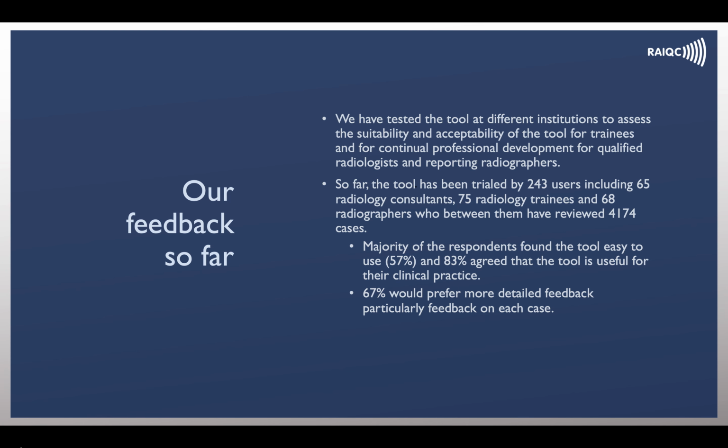So far, we've tested the tool at different institutes to assess the suitability and acceptability. We've tested it in over 200 users, viewing a total of 4,174 cases. The majority of users found it easy to use, and 83% of them agreed the tool was useful for their clinical practice. 67% would prefer more detailed feedback, particularly on each case.